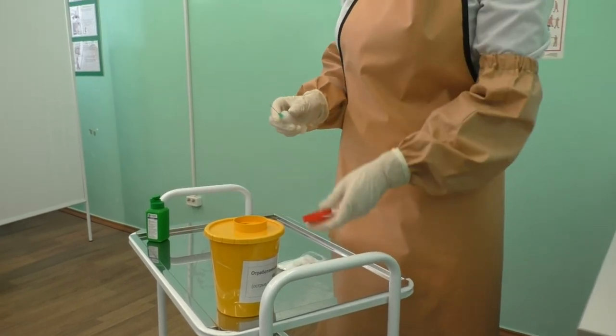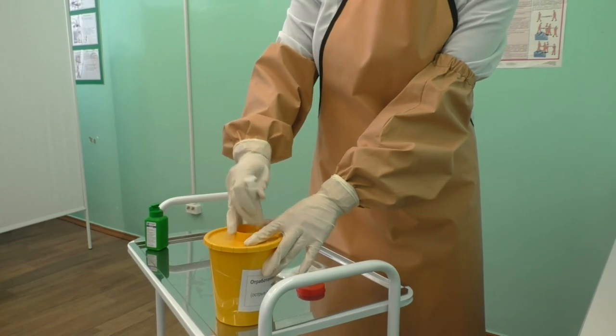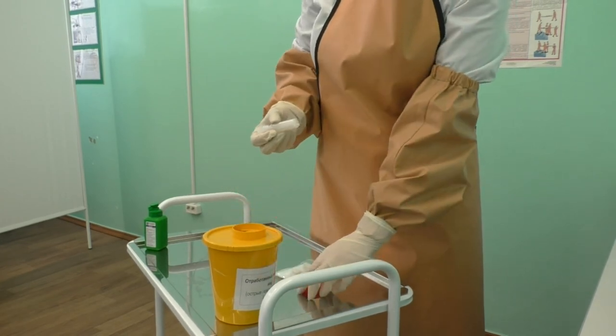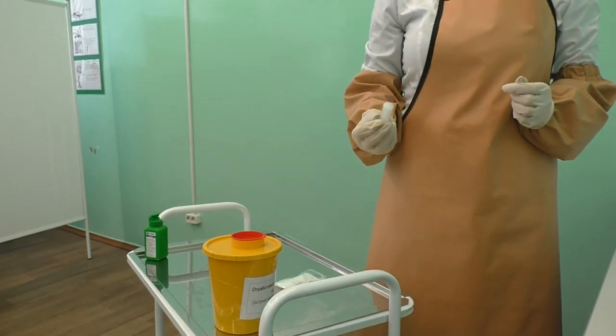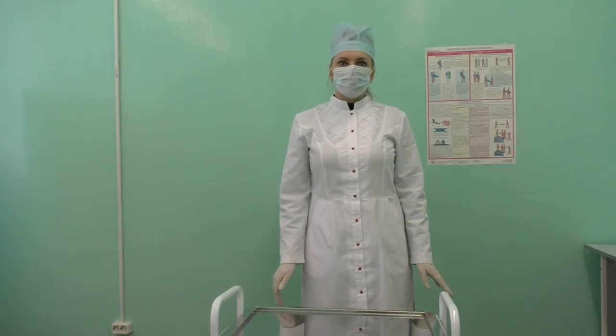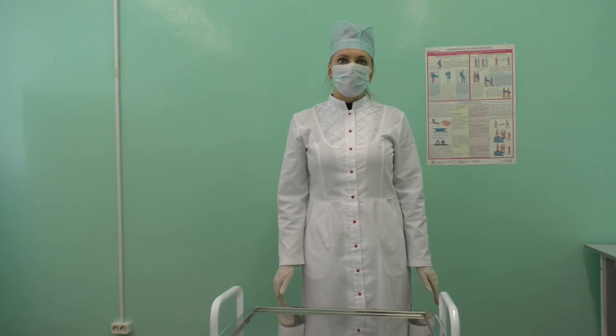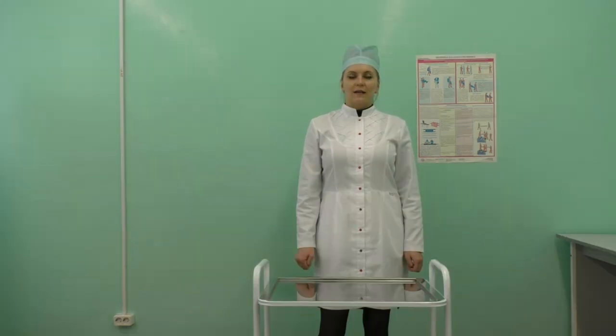Put the needle in the container for contaminated waste. Packaging paper will be placed in the container for non-hazardous waste. Put the syringe and cotton balls into the waste container for contaminated waste. Clean the apron, sleeves, and face shield with disinfectant.